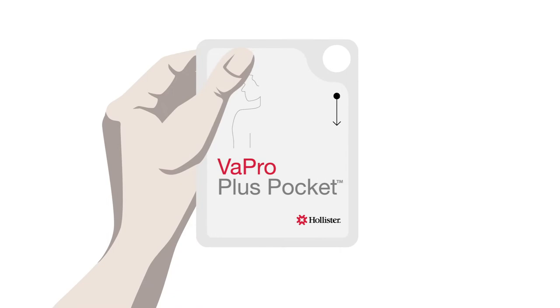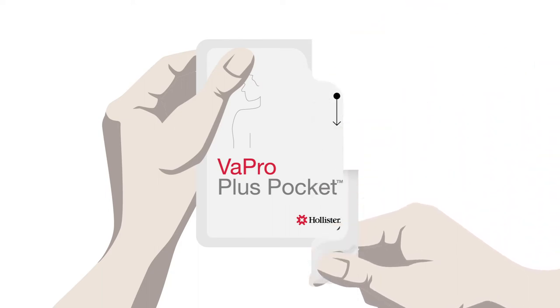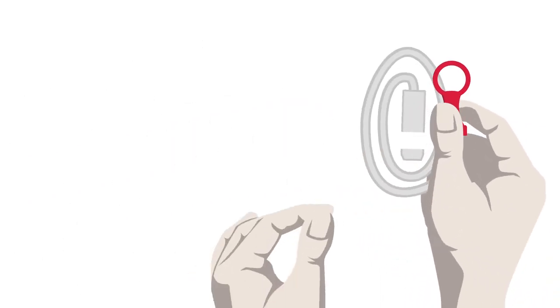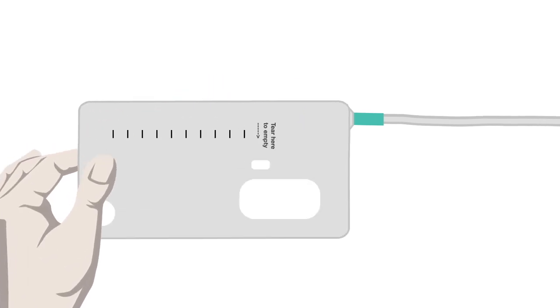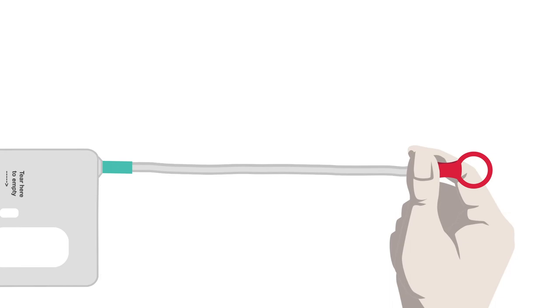This can be done by inserting your thumb in the finger hole or placing your fingers at the top of the strip and tearing downwards along the side of the package. Once the package is open, you can remove the catheter from the package. With the collection bag facing up, hold the catheter in one hand while pushing the bag away from the catheter with the other hand to break the paper band.